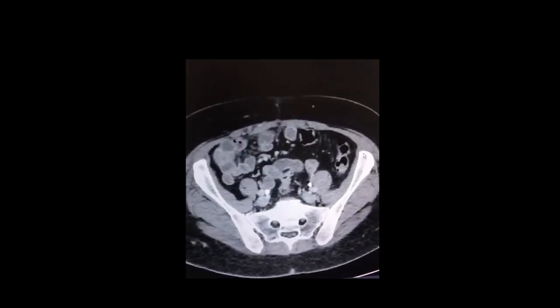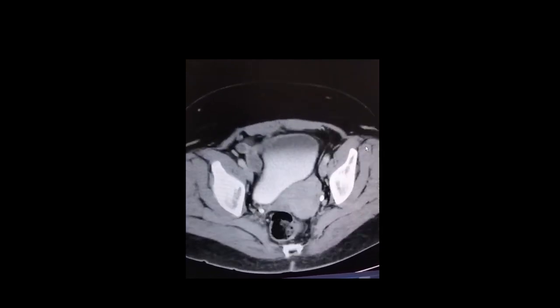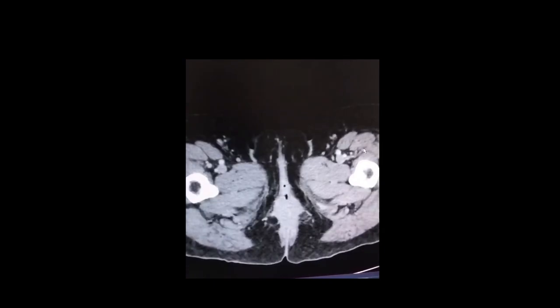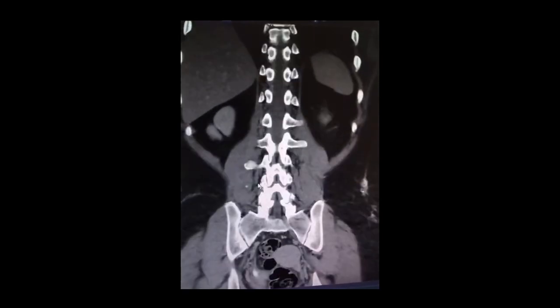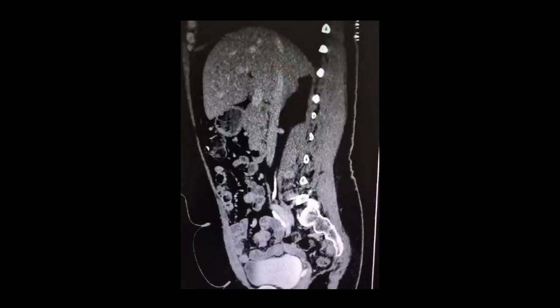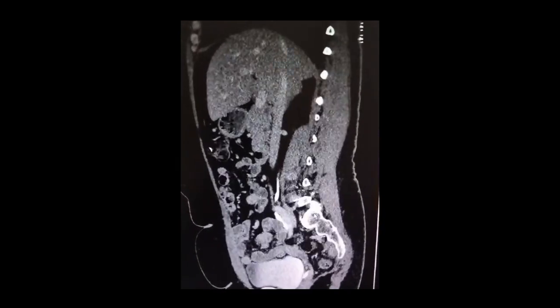Corticomedullary phase, the first phase of renal parenchymal enhancement. Nephrographic phase, the kidneys after contrast injection. Excretory phase, which opacifies the urinary collecting system, ureters, and bladder. CT systemic venous phase, performed after intravenous contrast has been administered, with imaging taken during the phase when the veins have the peak concentration of contrast.